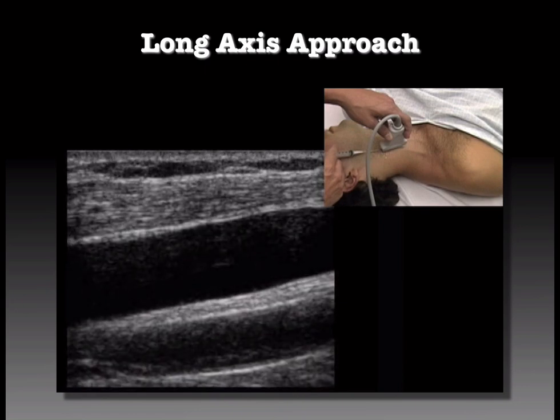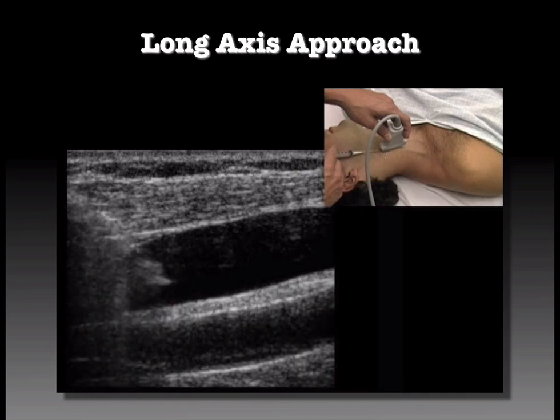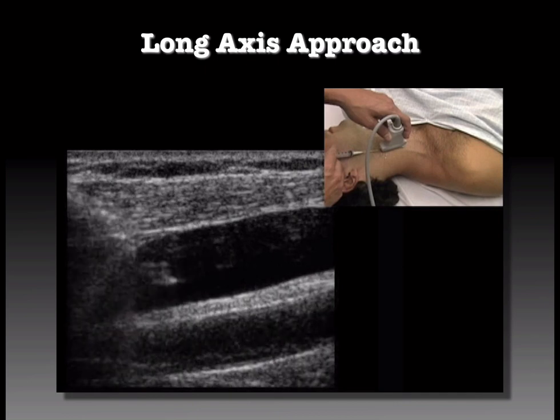We can see the carotid artery posterior in this real image. And as the needle comes down, we can stop before we go out the back wall, before we even get close to the carotid artery. This is a safe procedure.